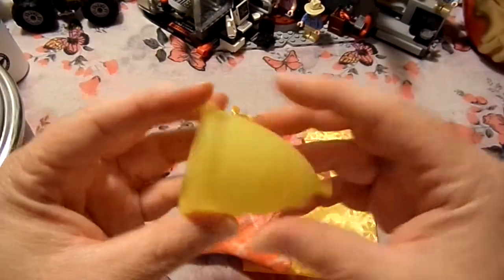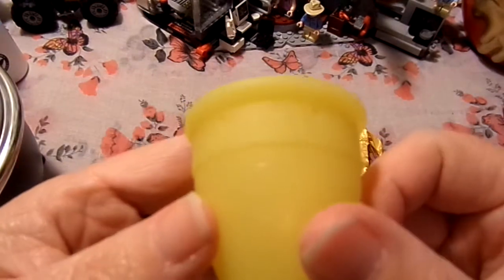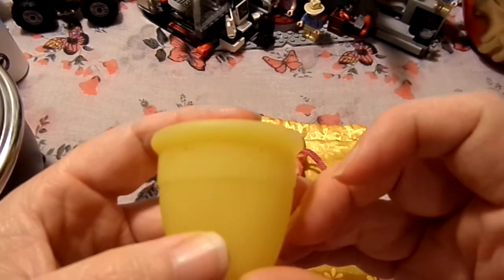This seems like a comfortable section. There are 4 holes up the top, so there's 2 on either side.